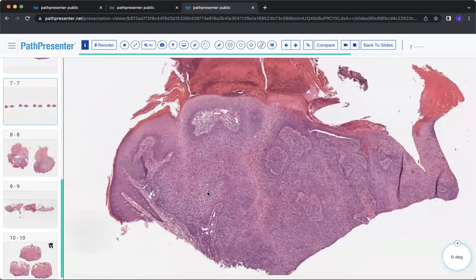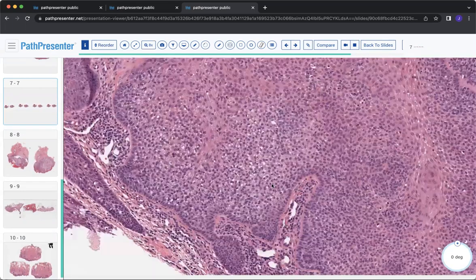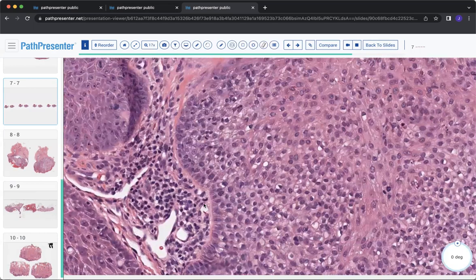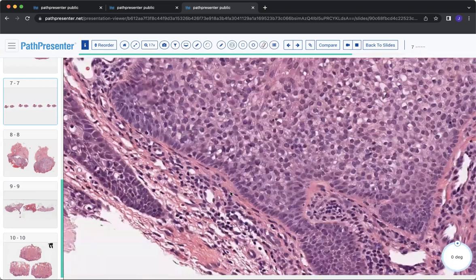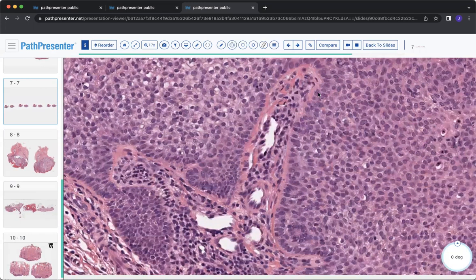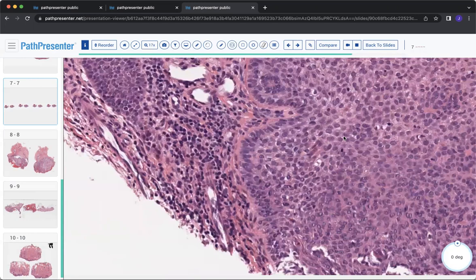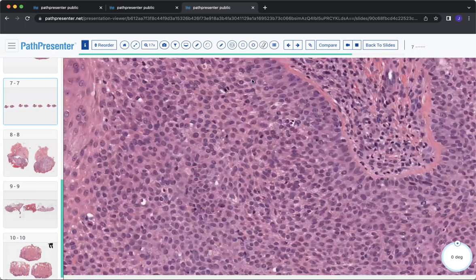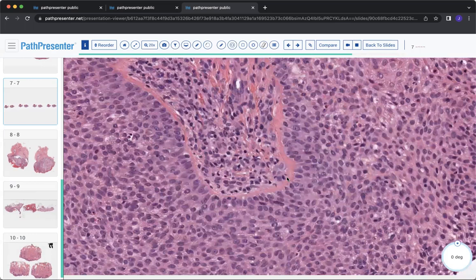Here is another biopsy. Again, you're going to see this clear cell population, and you're going to see this organized eosinophilic rim with long areas of really delineating and tracing out that peripheral palisading. And so again, to the untrained eye, you might be thinking about a basal cell carcinoma, but look how homogeneous and monotonous the cells are. Not a lot of mitotic figures, not a lot of pleomorphism. Again, just another great example of how organized and thick that eosinophilic rim can be in a trichilemmoma.